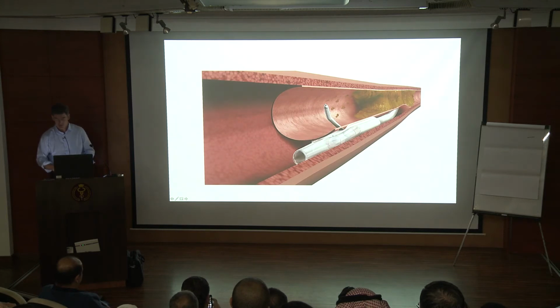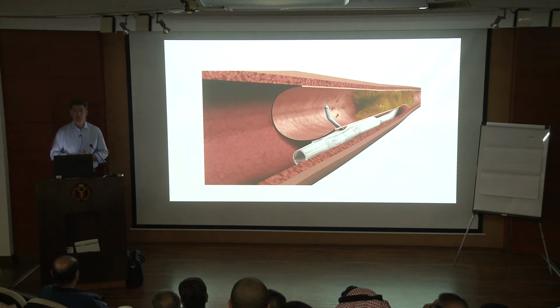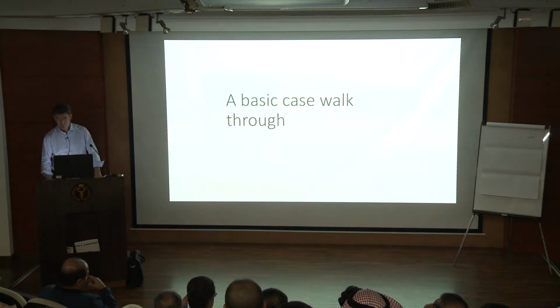I think when we took that out of the patient yesterday, you could see the exit of the wire coming out of the side of the balloon. Now, this seems simple. However, in the case yesterday, you will have noticed the patient was quite fidgety. Just at the crucial point, he decided he didn't want to be on the table anymore, and there was some movement. That is made more difficult if your landing zone is compromised in some way, or there is disease within the landing zone. That makes the ADR re-entry more challenging, but still possible.